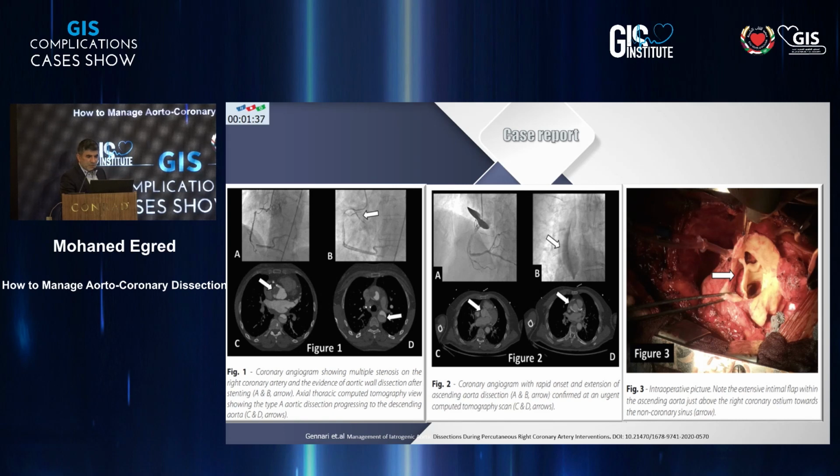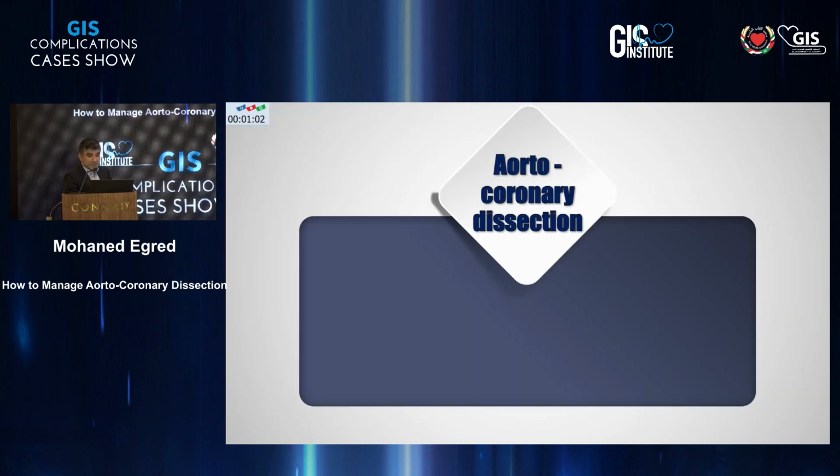This was another case also with some images that was sent for surgery. And from the beginning, you could see the little line from the right coronary artery starting to appear. And again, you continue to inject, and this is what happens. It's inevitable because the dye has to go somewhere. And when you're injecting through the small catheter, particularly diagnostic, in fact, you're generating high PSI, 600, 700. So you are going to propagate this. So really be careful with this. And you go for surgery, that's what they found. So it can cause a big problem. It can lead to death even.